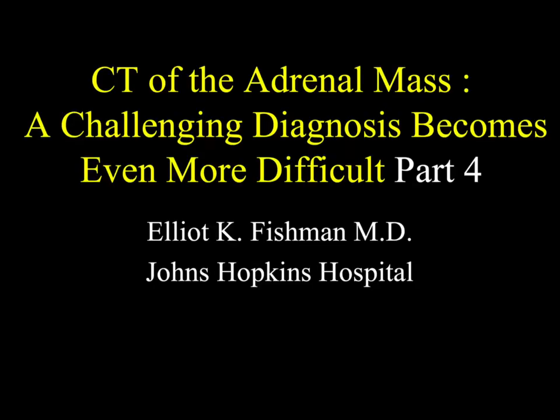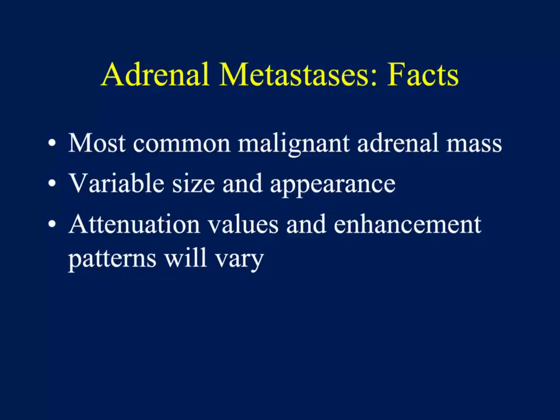Welcome back to the evaluation of challenging adrenal masses. This is part 4, and this should be the last part. Now, I left off last time mentioning metastasis. It's the most common malignant adrenal mass.